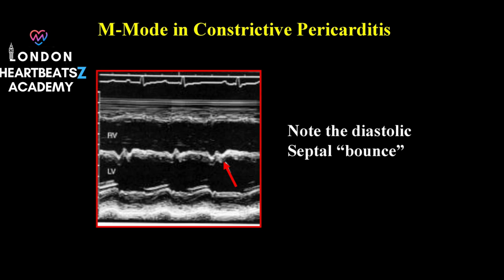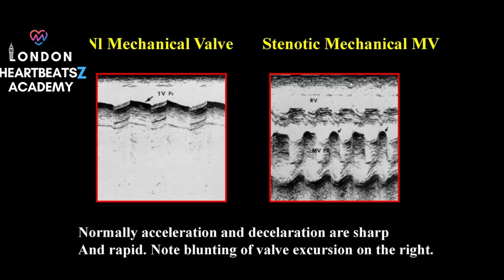Wow. It's like taking a virtual tour through the heart's inner workings. We've uncovered so many amazing applications of M-mode today, from diagnosing life-threatening conditions to assessing heart function in a really nuanced way. It seems like M-mode is much more than just a historical footnote in echocardiography. Absolutely. It's a testament to the ingenuity of this technique and its enduring relevance in cardiology.